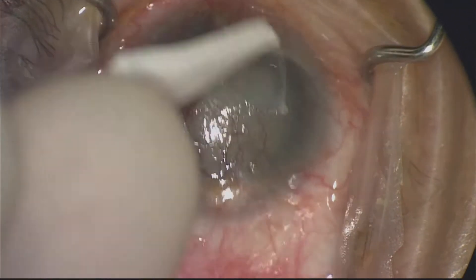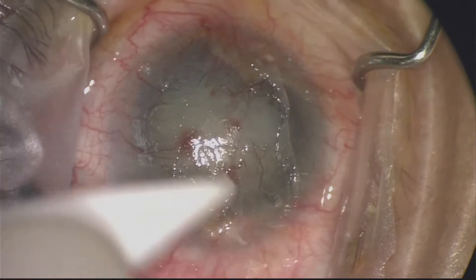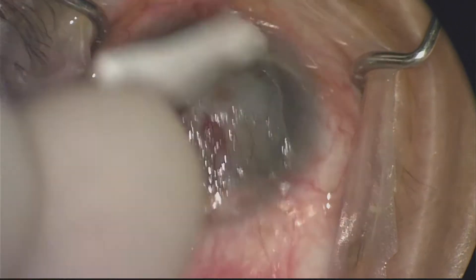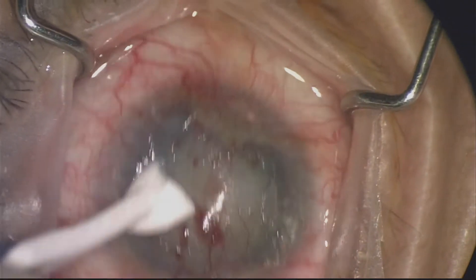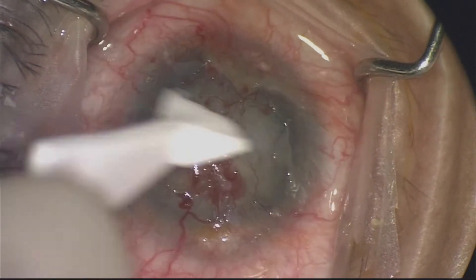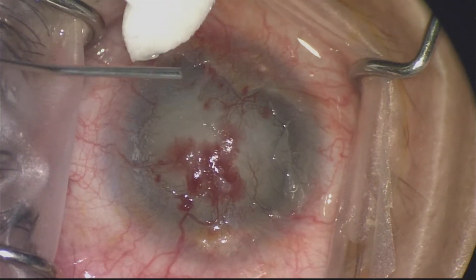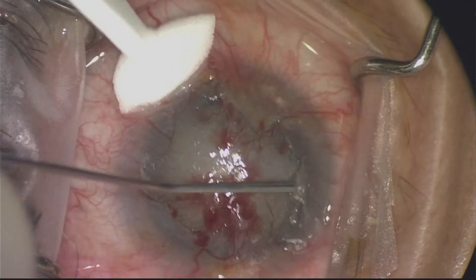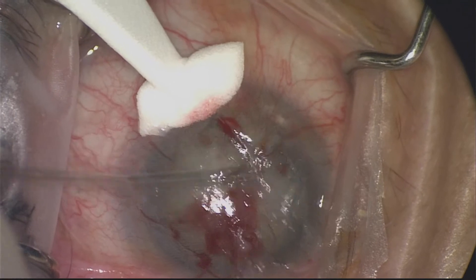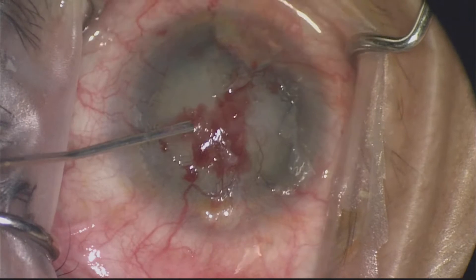This case is really challenging when you're not focusing too much on the stem cell deficiency but trying to manage a cataract and plan for a stem cell transplant later on. You can see the conjunctivalization of the cornea from previous pathology. Initially I'm keeping the corneal surface quite dry, taking the epithelial layer off on top, and then dealing with a superficial keratectomy.